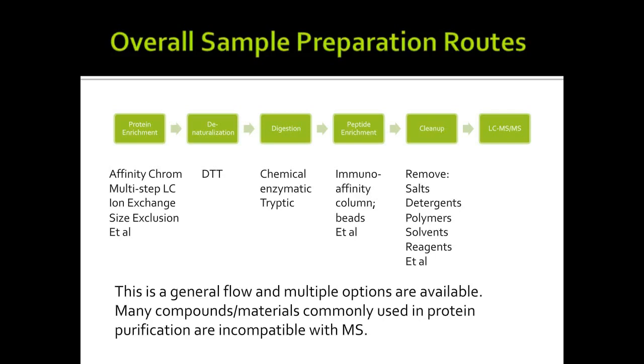Those methods we typically use for protein enrichment. And then we have to use denaturation. The native state will be difficult for the next step, which is called digestion. So we want them to denature and separate the disulfide bonds so that they completely relax in the solution.